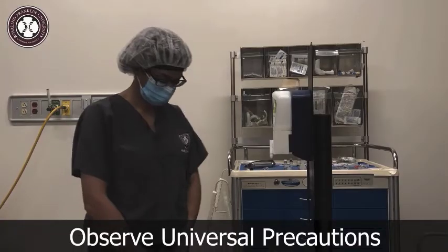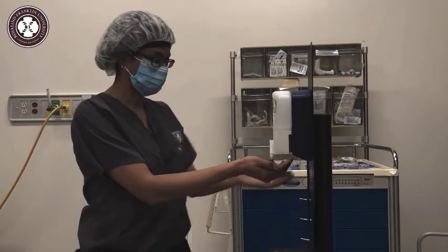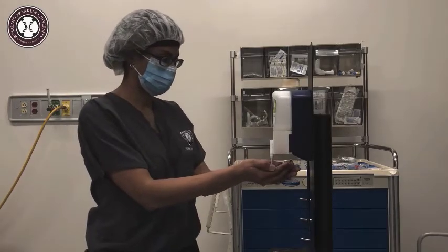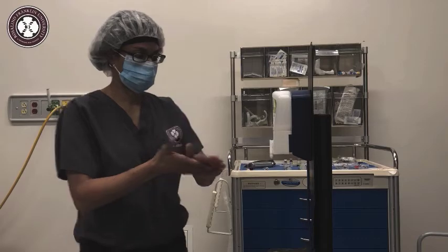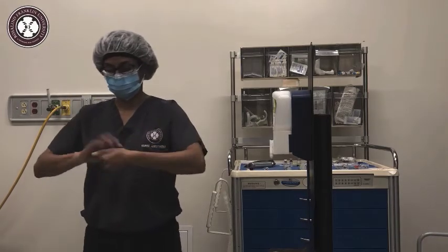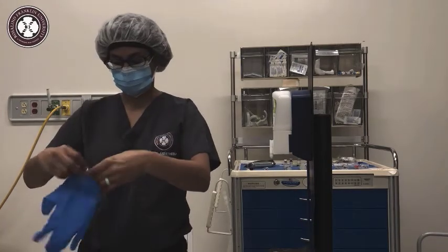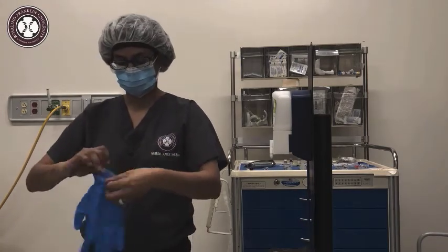Be sure to maintain universal precautions. The provider should at minimum be wearing a surgical cap, a surgical mask, and gloves once hand hygiene has been performed.